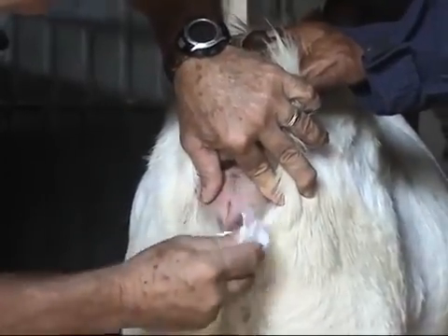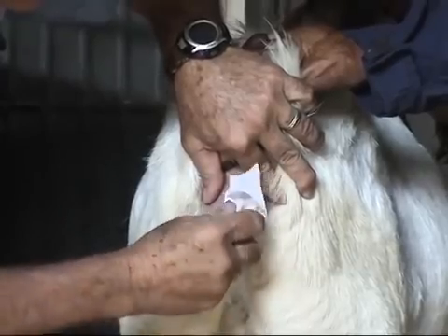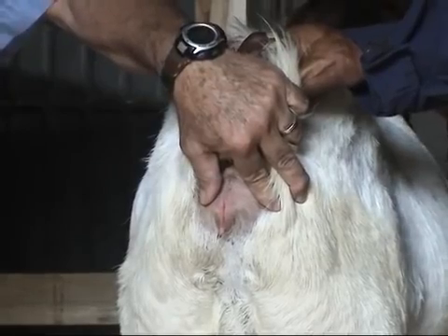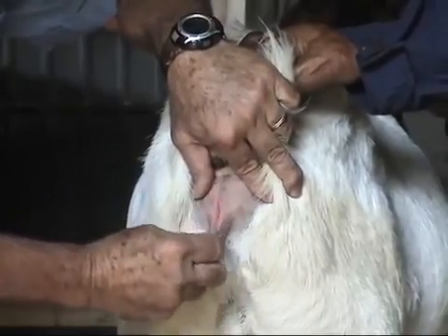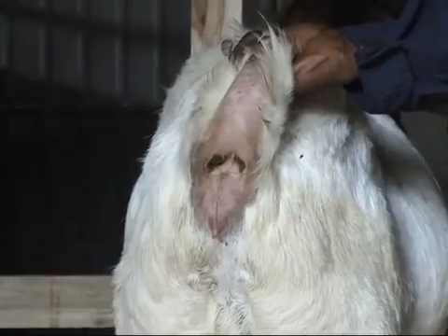We want to make sure that it is dried off, because if you have a lot of water still on the area and you carry it inside, water is spermatocidal — it will kill the semen that's in the straw. So you want to dry everything off that comes in contact with the gun and the speculum. Okay, so now she's ready to examine.